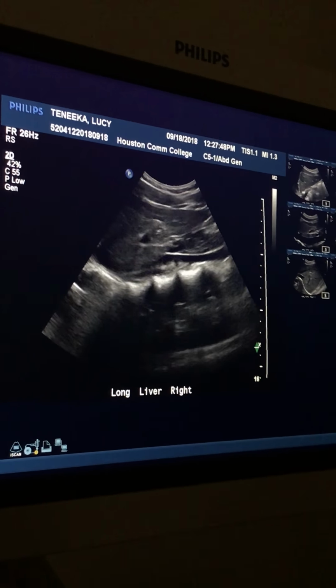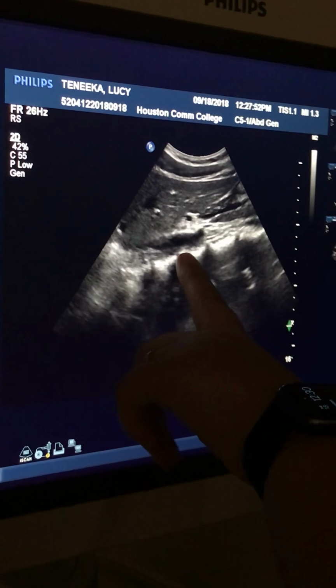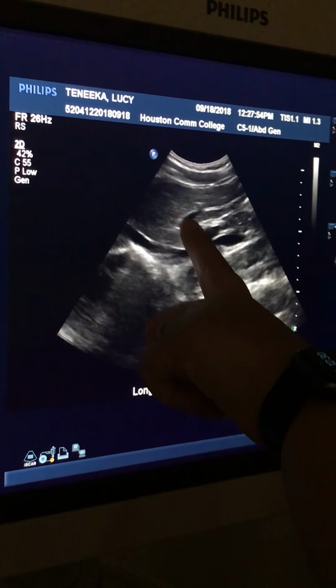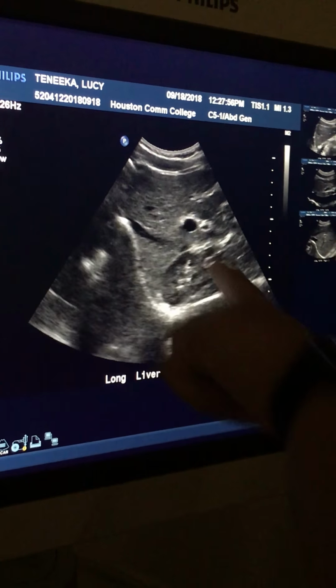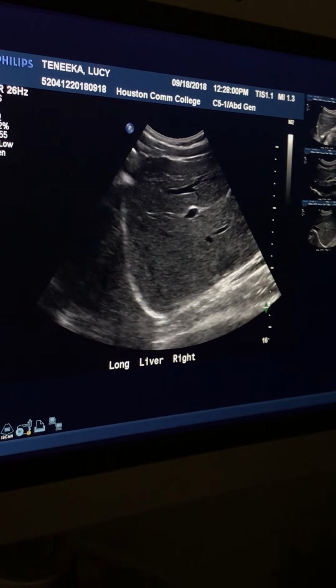Okay, so we're going to do it again. Deep breath and hold it. So again, there's my aorta, there's my IVC, there's my left, and I'm going to keep angling. There's my right, and then I'm just going to clear up the picture. I'm literally just angling toward her shoulder right now, and then twisting. And here comes the kidney again. And this picture actually is not as bad. You could take that.